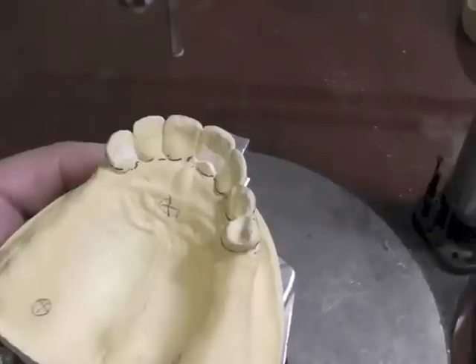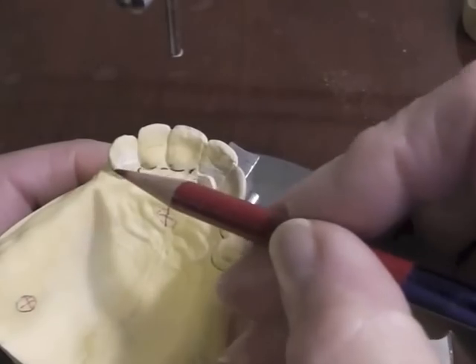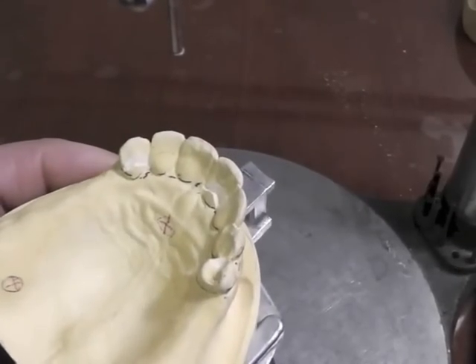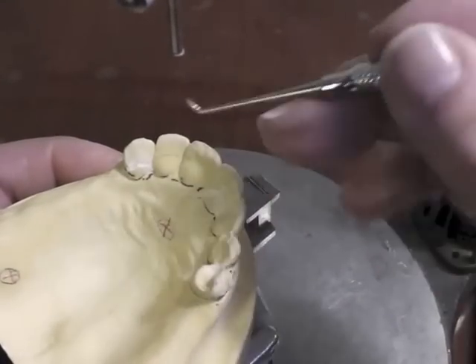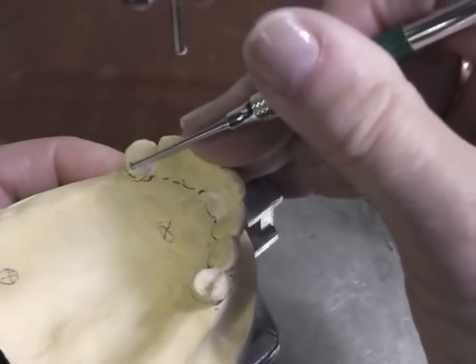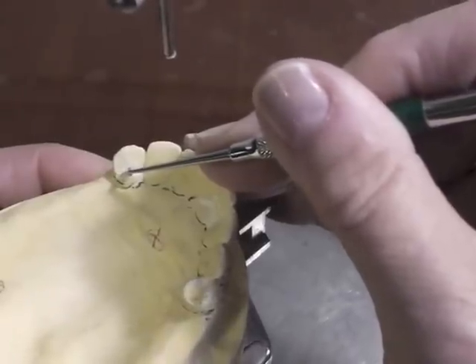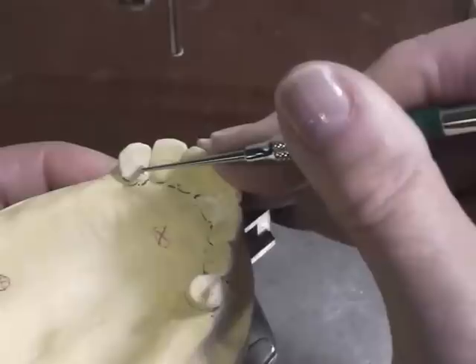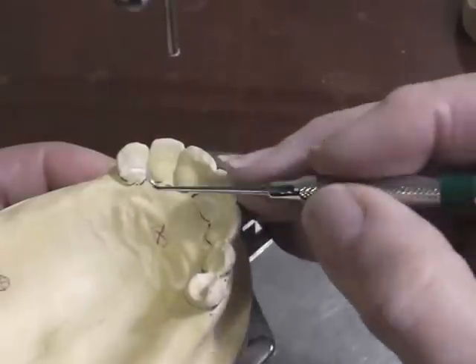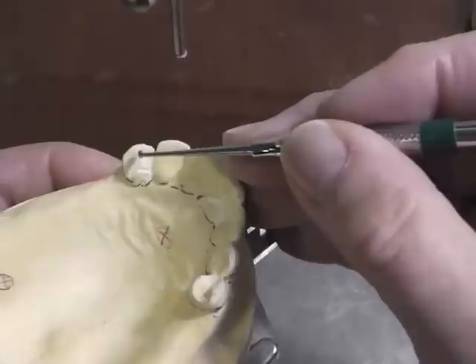I would start by placing my cingulum rest. Before I drew it, I would take a burr — I've already cut some of these to save time on the recording — and I would take an end-cutting tapered diamond to form a little ledge in this area. I want this to be at least a millimeter into the depth of the tooth, usually at the junction of the middle and cervical third.